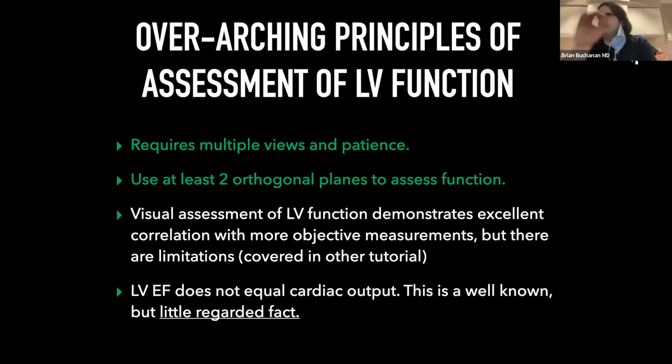And so we're going to talk more about a categorical approach than a specific number. That way we buffer against those arguments of 10, 15%, but hopefully you can distinguish between, say, a severely depressed and normal. And of course, LVEF does not equal cardiac output. Honestly, if there's one limitation that I can tell you about, it's this one. If you have a big dilated LV and your ejection fraction is 20%, you may still have a normal cardiac output because your stroke volume may be quite large, if you have a very large chamber. So that's one thing to be very mindful of because it can limit the actual implication of a low EF.